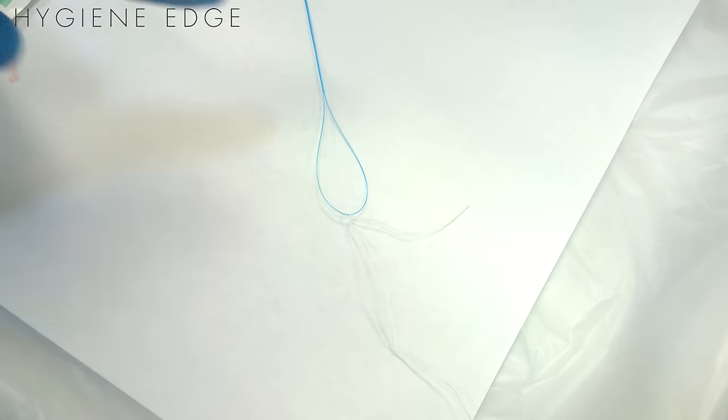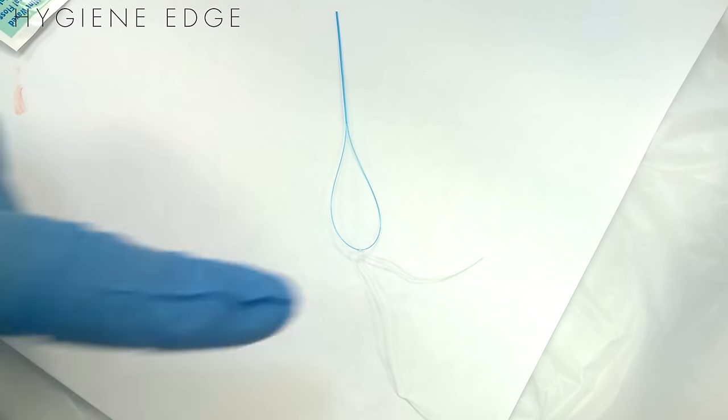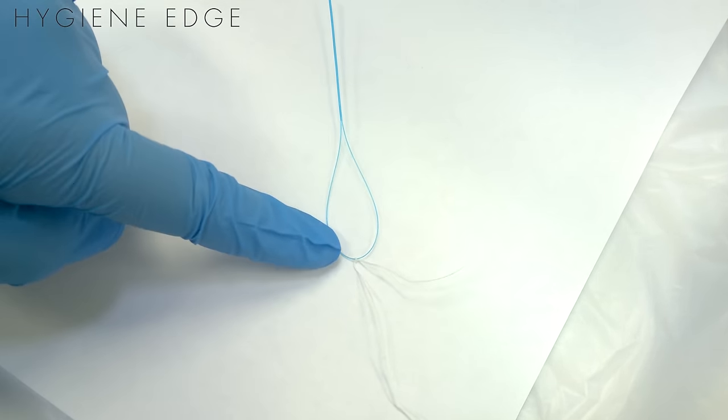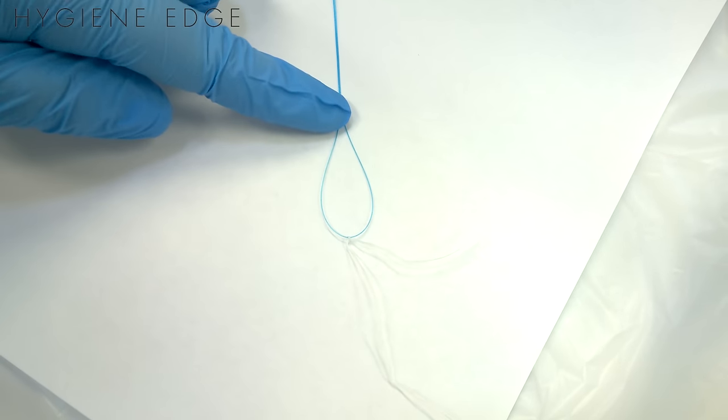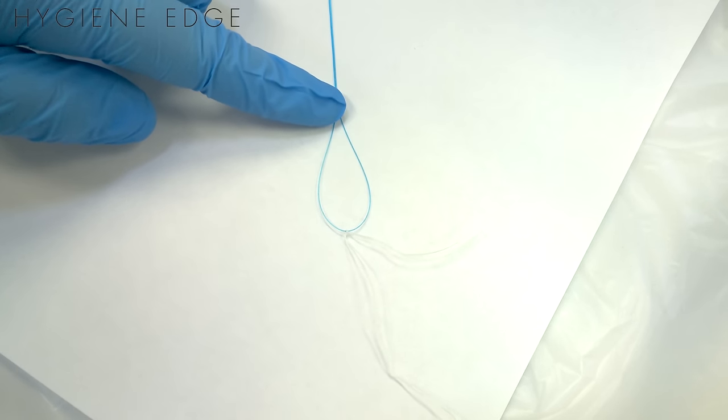We're going to show you how to floss with a regular floss threader and floss. One thing I like to do is tie my regular floss onto my threader so it doesn't constantly come out of the loop as you're going through and flossing your patient. It'll help you save a lot of time in the long run.